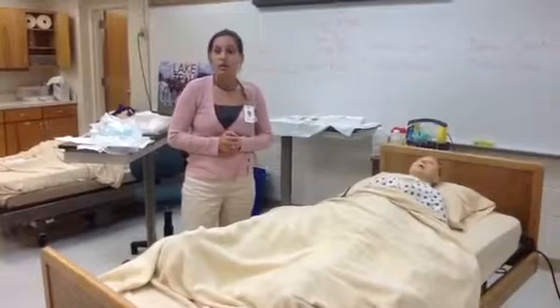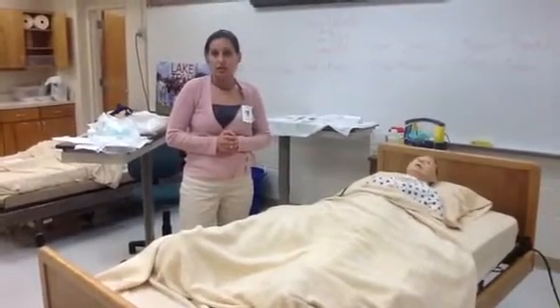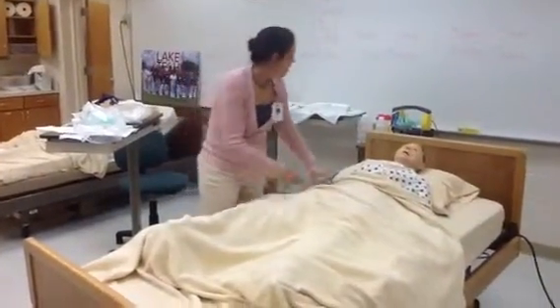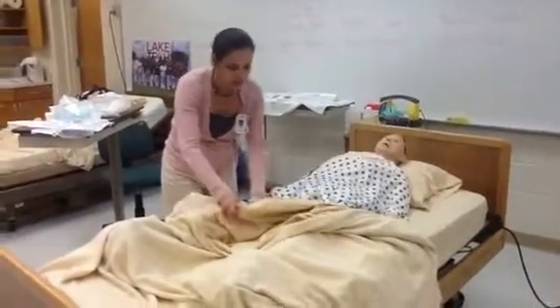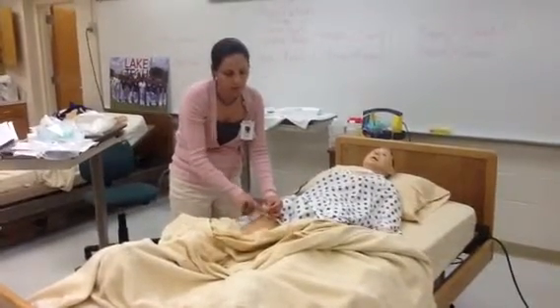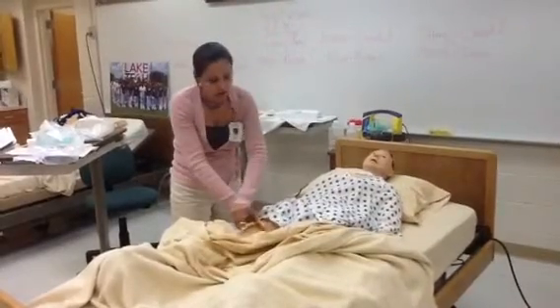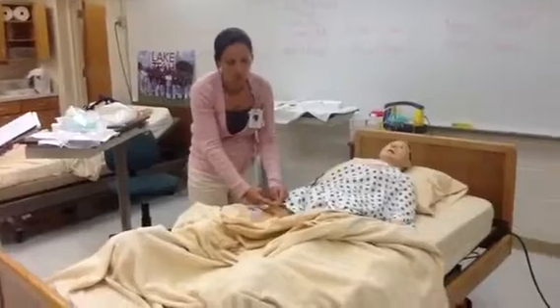To secure the catheter, we want to secure it in the hard, clear plastic tube instead of the yellow to allow more movement for the patient. That is the place that we are going to put our stretchy band tape on, at the Y connection. Okay, because if we allow a piece of tape to go like this, it gets stuck. We want it at the Y connection.